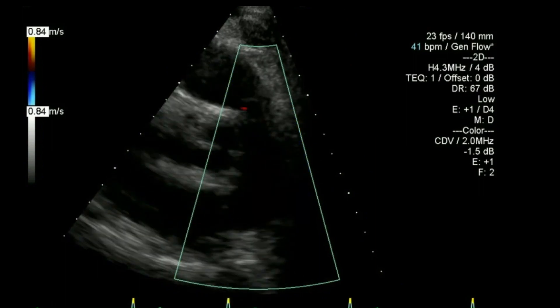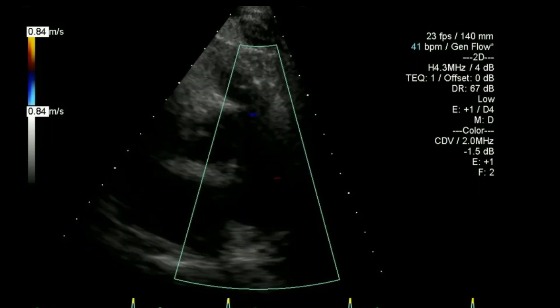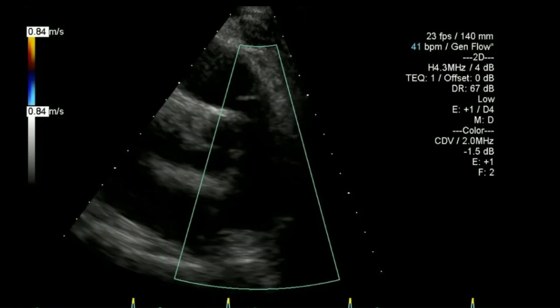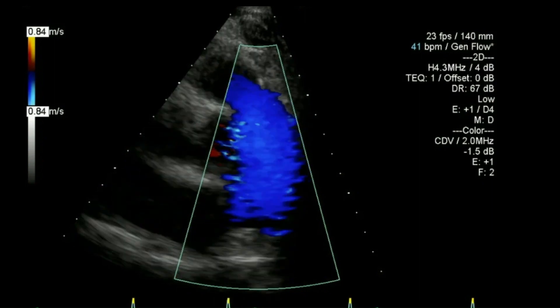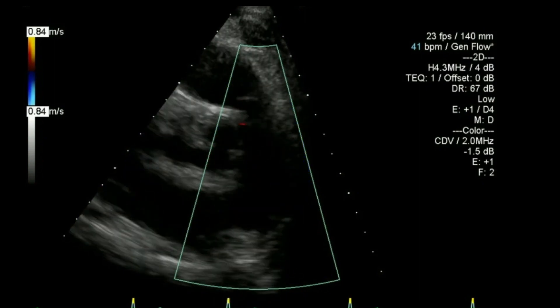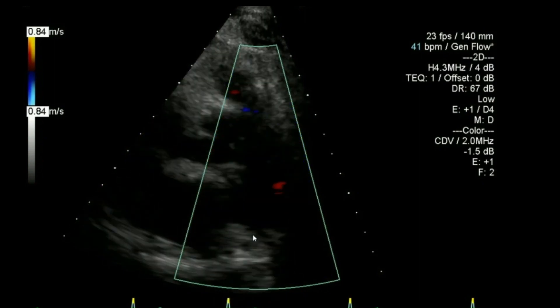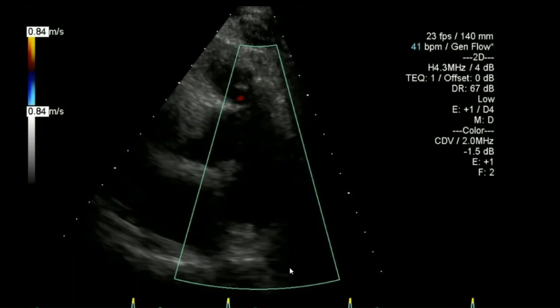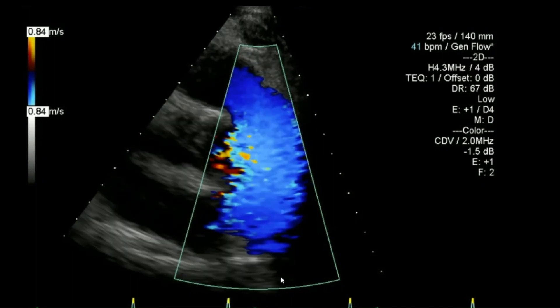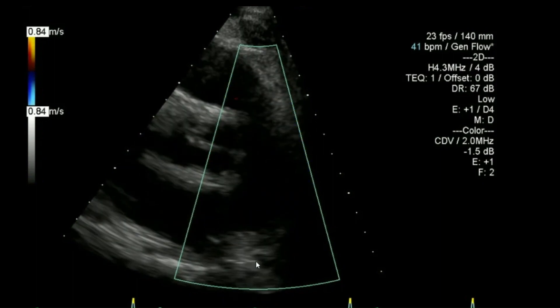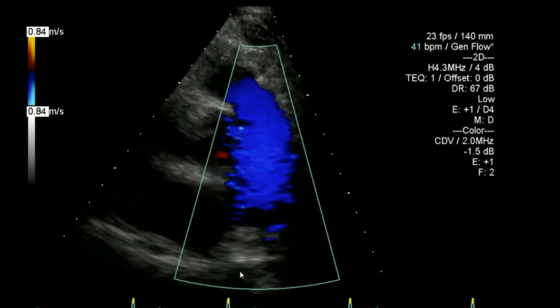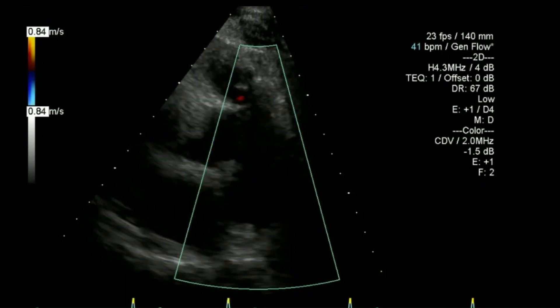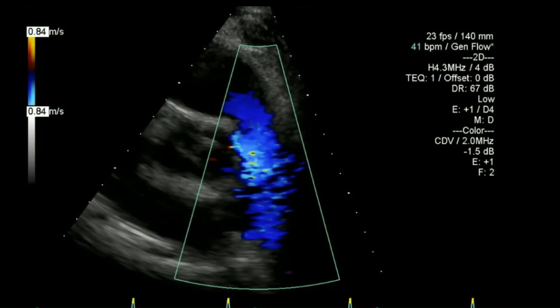Putting my colour scale back up, I've twisted over to the pulmonary artery so it's more in the middle of my picture. In this view I like to be able to see the orifice of the right and left pulmonary arteries as much as possible, and also look for a descending aorta down here — I would see PDA flow there if there was any.